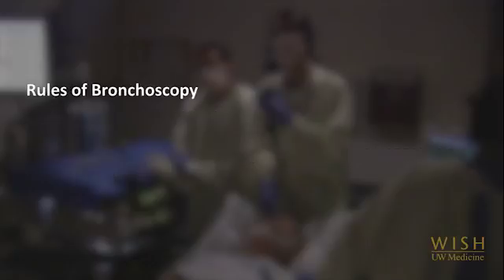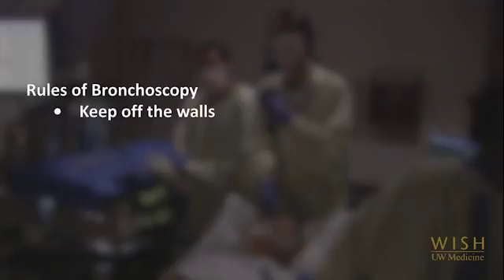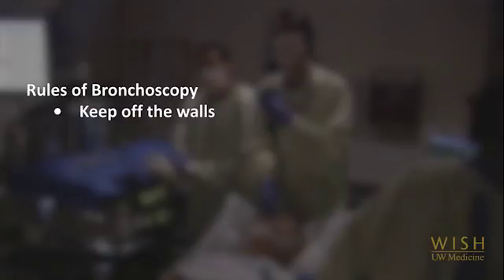During the movie, note how the bronchoscopist abides by the rules of bronchoscopy. Keep the tip of the bronchoscope in the center of the airway. This reduces trauma and irritation of the airways. Keeping the image in the center of the screen also helps those watching you to know where you are and to feel less dizzy.